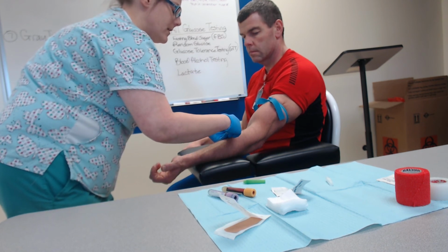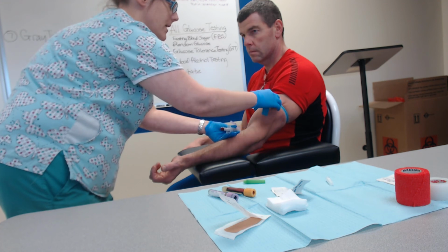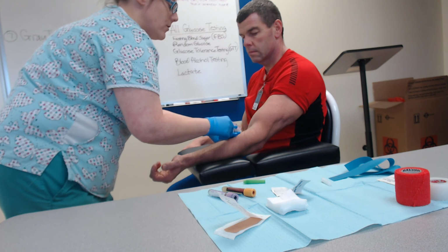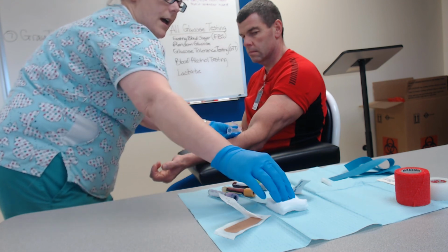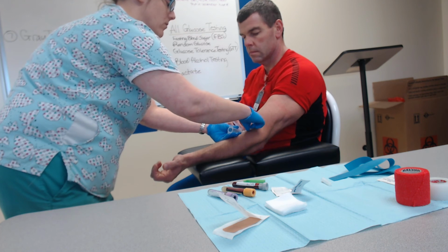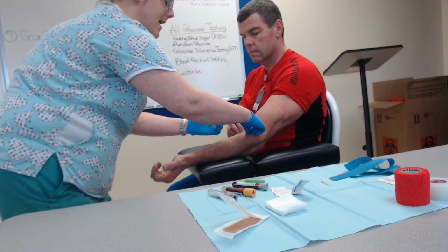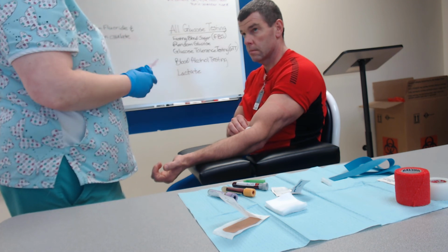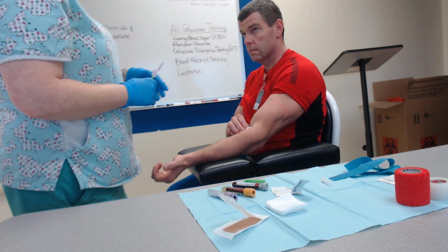When you get to your last tube, that's when I would take your tourniquet off, because remember, it only needs to be on for a minute. Take your tube out and go ahead and grab your gauze, place that over the needle, and then pull your needle straight out, and that will go into your sharps container. You can have the patient hold pressure, and then we'll go ahead and apply the bandage.